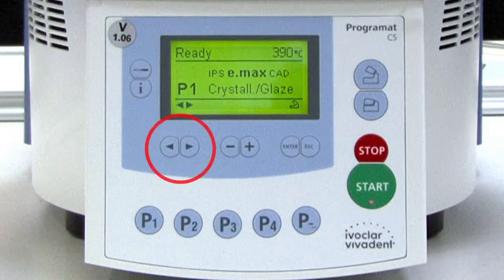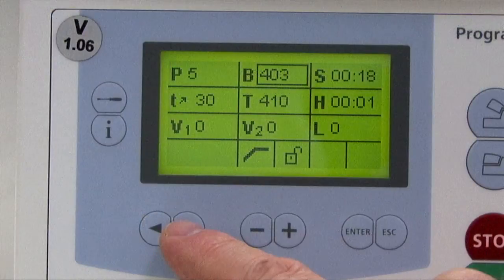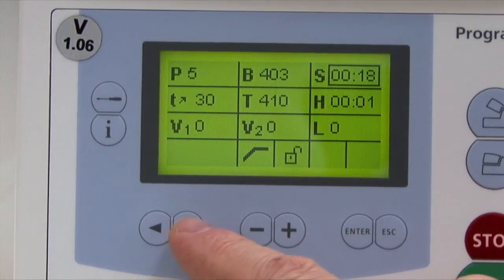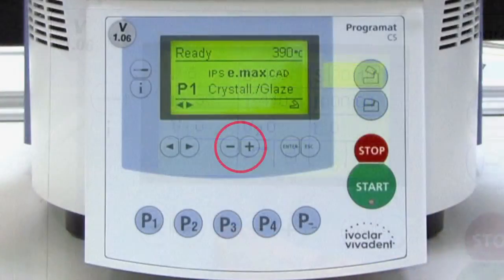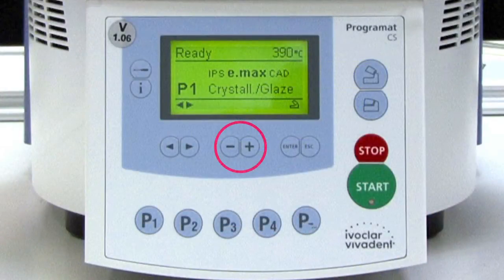The cursor keys can be used to browse or toggle through the settings and/or information. In the list of firing parameters, the current cursor position is indicated by a non-blinking frame around the numerical value. The minus and plus keys allow for the entry of a numerical value. Each entry is automatically accepted, providing the corresponding value range is observed.